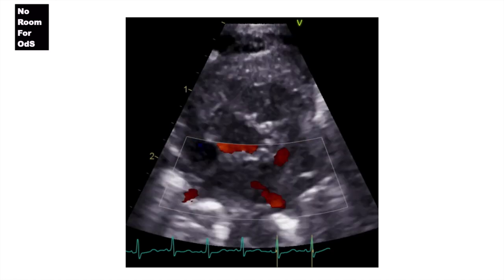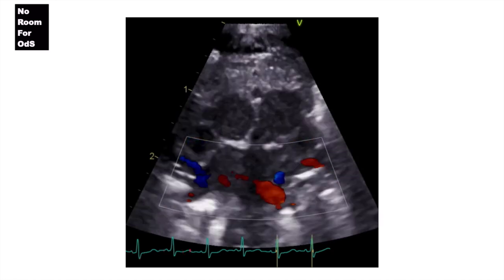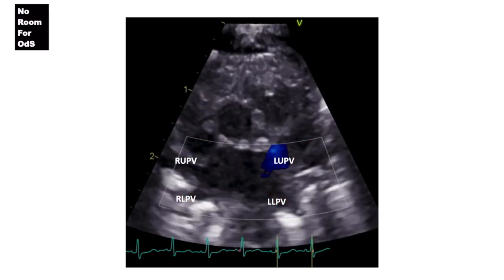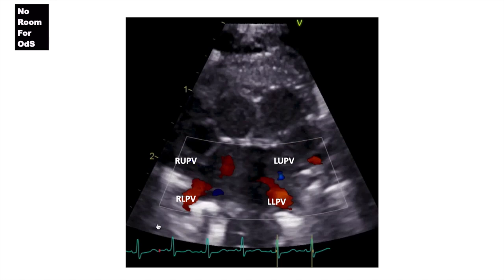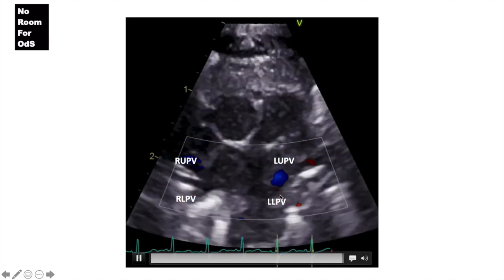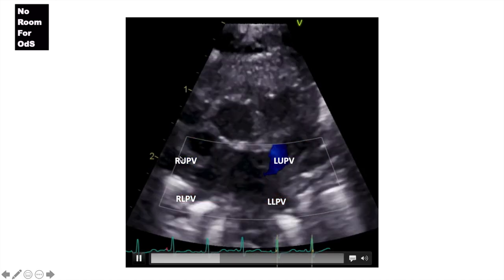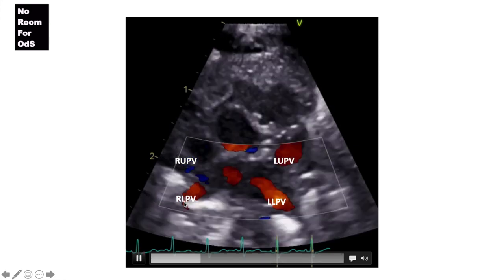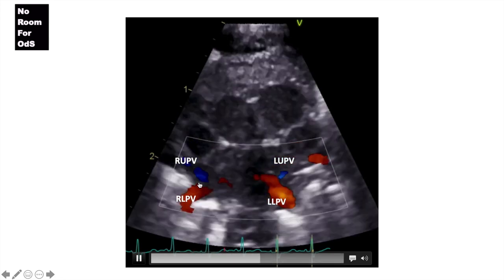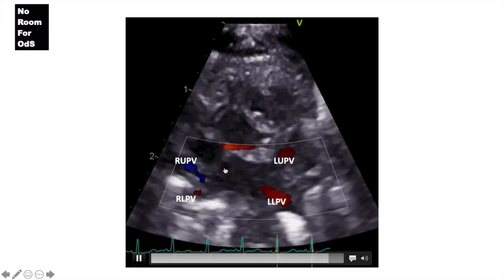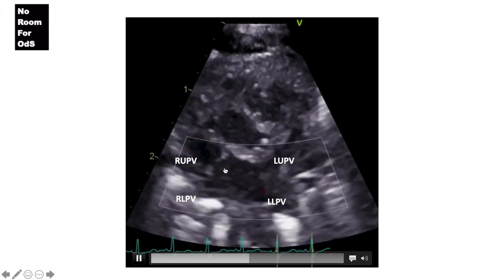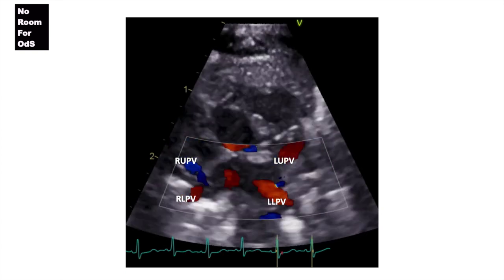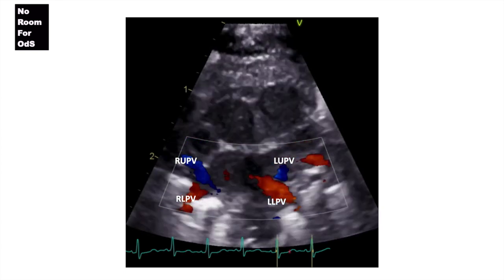After the 2D view, we put the color on. You can see the four pulmonary veins — the left upper and left lower pulmonary veins on one side, and on this side the right upper and right lower pulmonary veins draining into the LA. This is very reassuring, especially if you're trying to rule out abnormal pulmonary venous drainage.